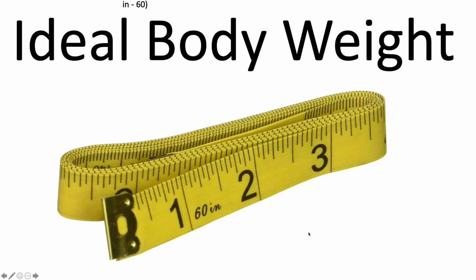Another nice thing to have on the rig or on the helicopter or in the resus bay is a tape measure. So you're not just guessing the patient's height, you can actually get an accurate height.